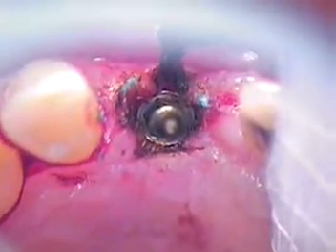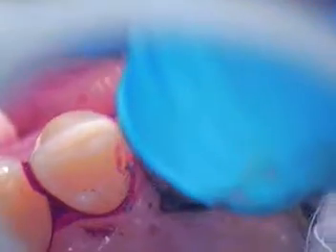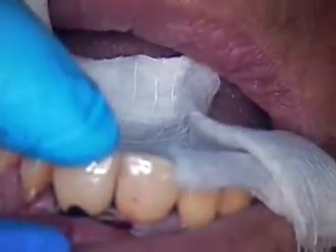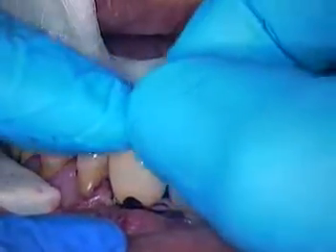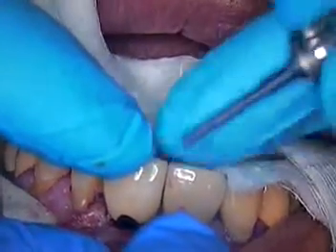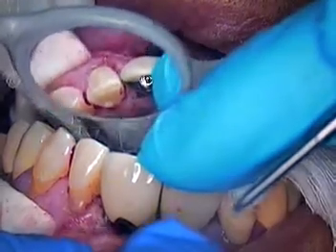Okay. Driver. I'm just going to back down out and just retract only. Okay. You okay? So we're seating it now. Make sure we have a positive seat. Turn it a little bit. The hex is engaged.